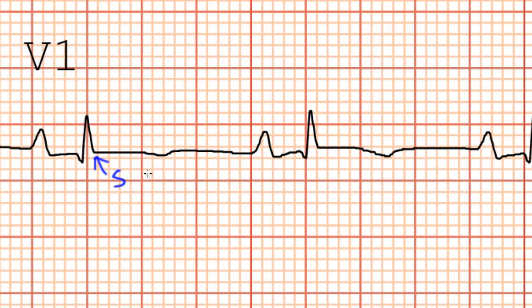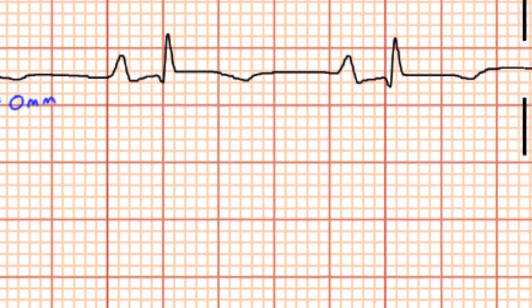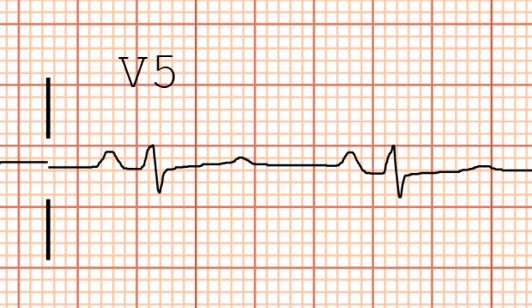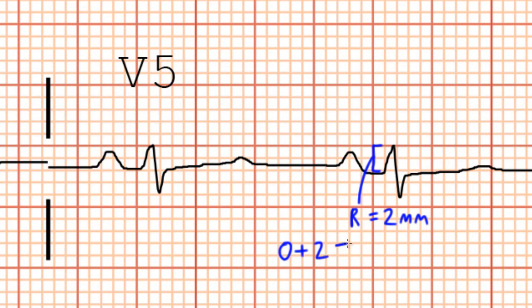We can see that the negative deflection in V1 is about 0 millimeters. Now let's move on to lead V5. Looking in V5, we can see that the positive deflection is about 2 millimeters. And so 0 plus 2 equals 2 millimeters, which is much less than 35 millimeters, and so we don't have LVH.